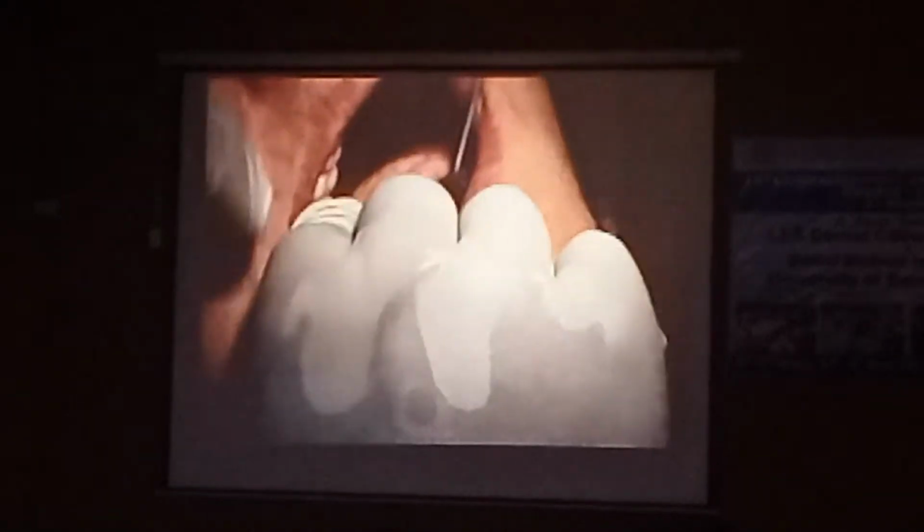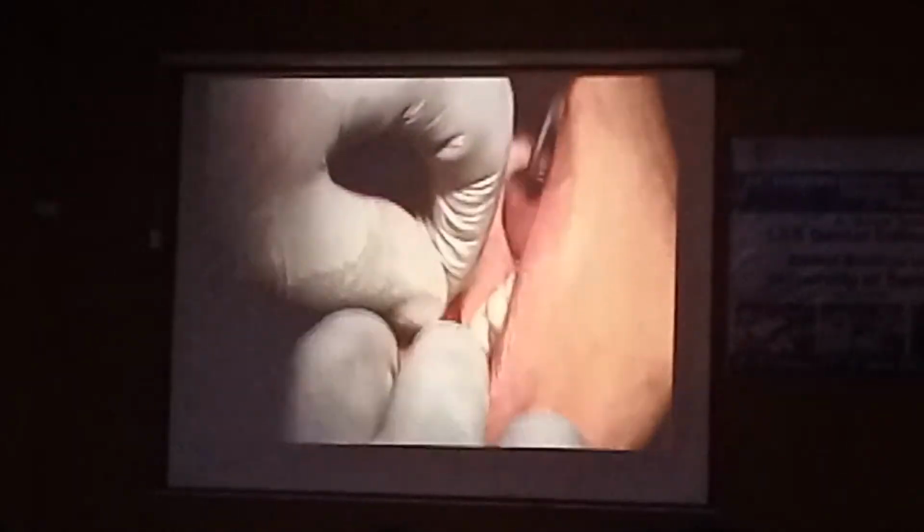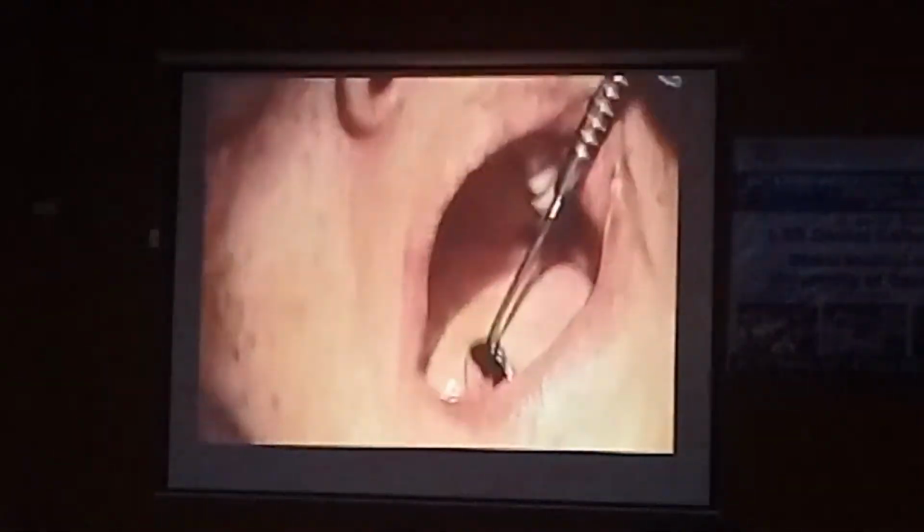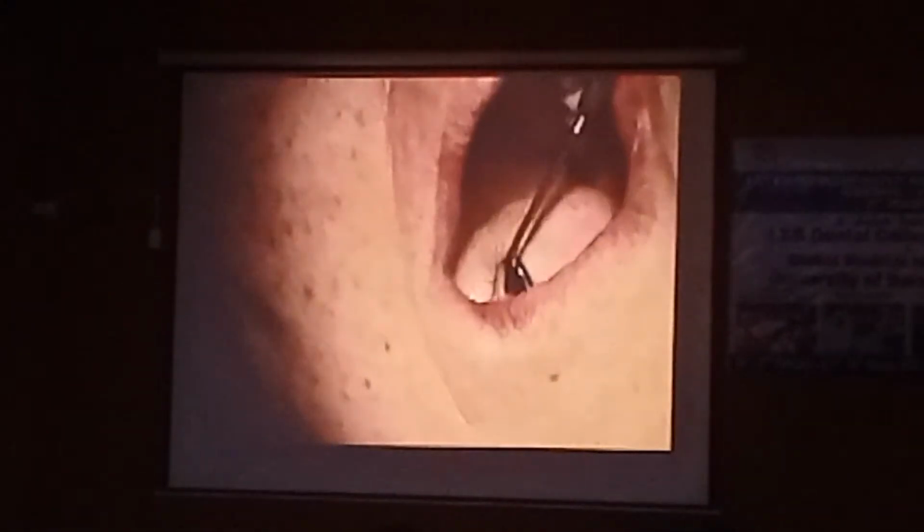This is a pickup jig. A transfer jig is used for transferring the abutment. The earlier jig was a verification jig. This is a sectional jig used to make a pickup impression, right? So ultimately the terminology is different based on the usage. The concept is the same.